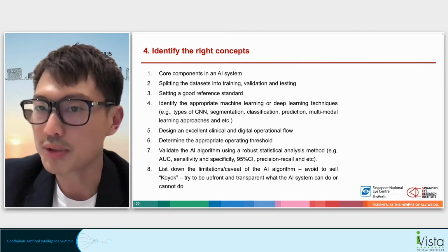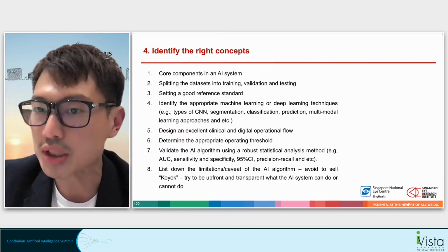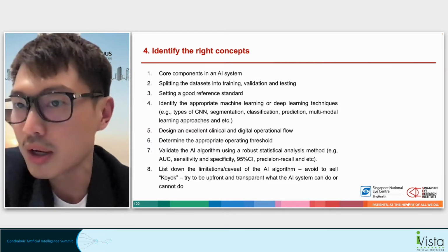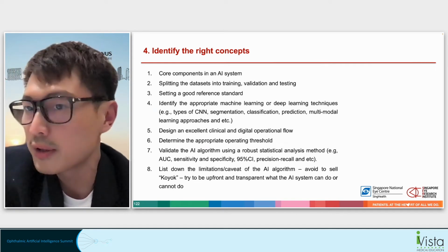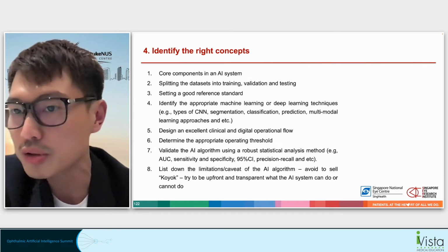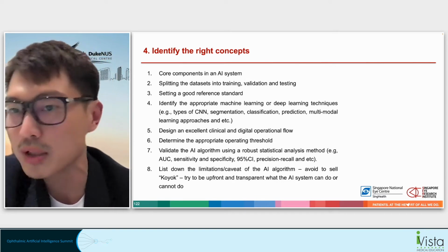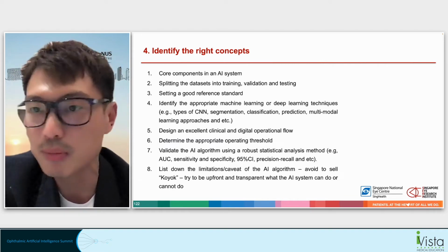And the right concepts itself. How do you build the AI architecture? I think this is where the clinician can come in, in a very important sense. It's no different from how you design the hospital settings. Where do you want the patients to go? Where's the waiting room going to be? How are you going to dilate the patient? How are you going to image the patient? Same thing in the AI system.